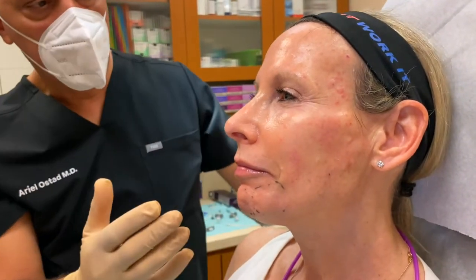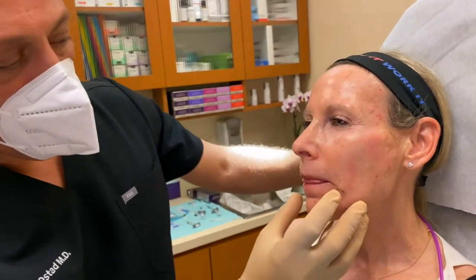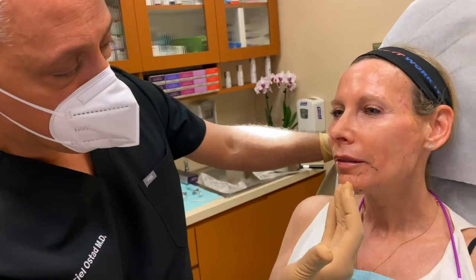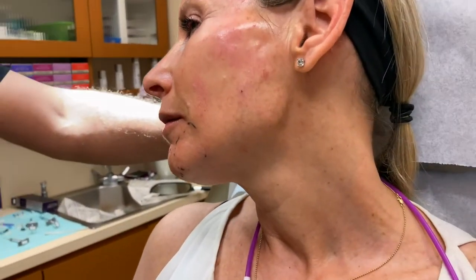If you notice, she didn't have much of a laugh line, so that's not an issue, but now we're going to correct her side profile where, again, she's a beautiful woman. On the frontal view, you may not see her receding chin, yet on an angle, I hope you can capture this. She has this recession here, we call. So we're going to go ahead and just inject that.